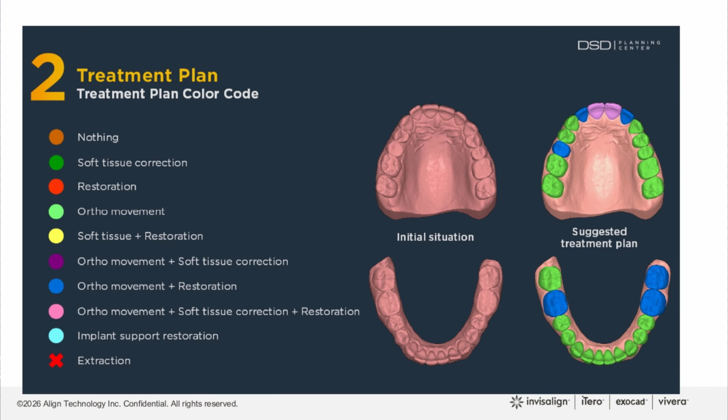And so working again with my digital lab, we come up with a plan. She then evaluates the plan with me, and she doesn't like the shape of the teeth. So then again, we talk about the benefits of moving the teeth, get some modifications done.